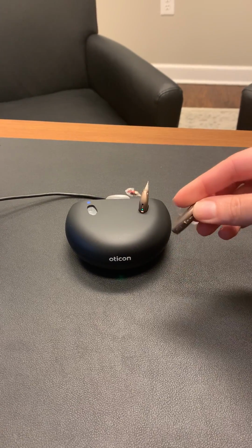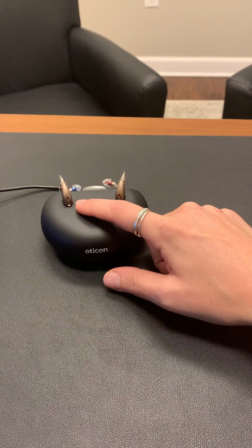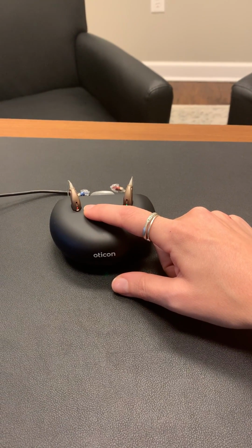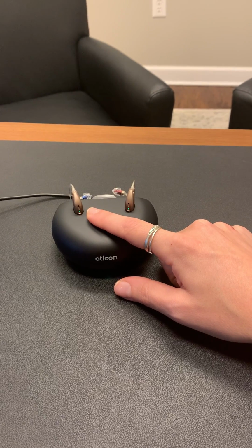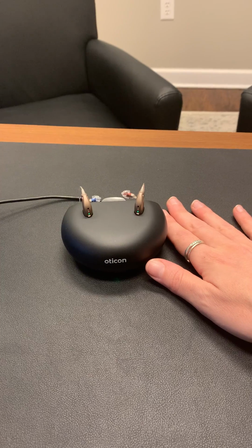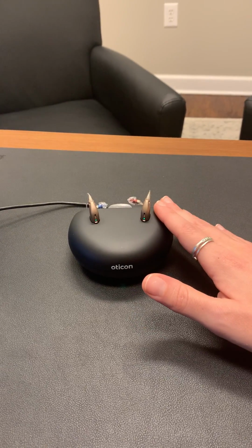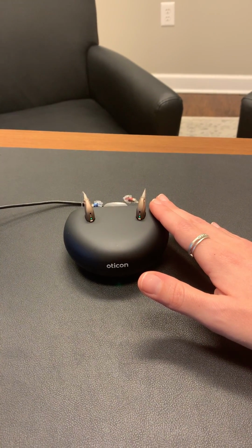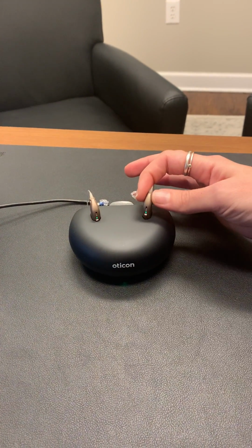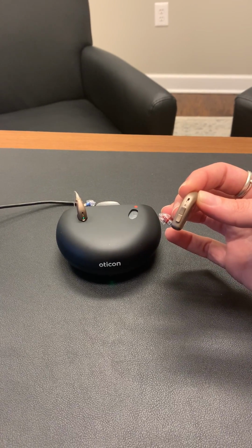We're going to insert it into the charger. Once it's plugged in, it will blink red, knowing that it's charging, and then it will turn green when it's fully charged. You cannot overcharge the devices, so you will keep this charger plugged in, put them in there at night when you take them out of your ears, and then when you take them out of the charger, they will turn on and they are ready to use to put in the ears.